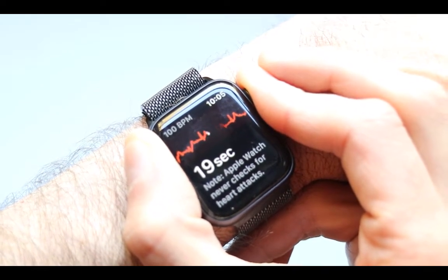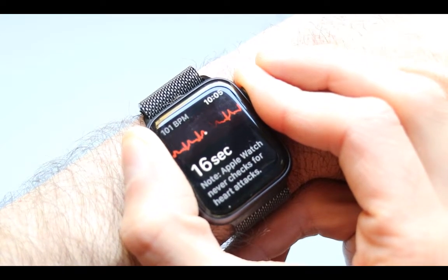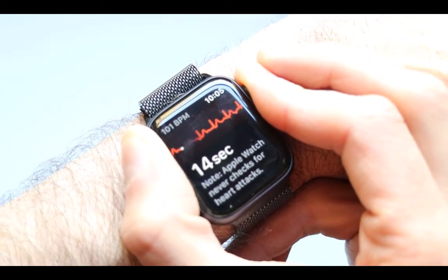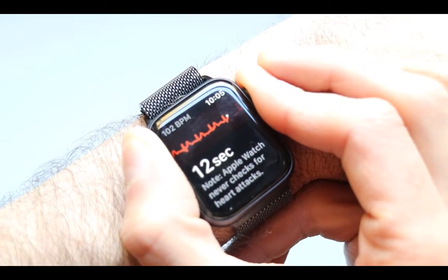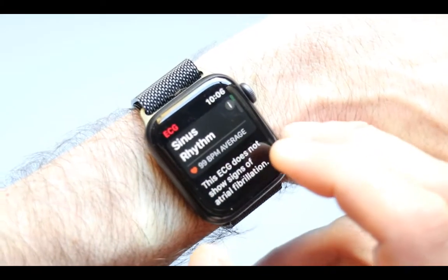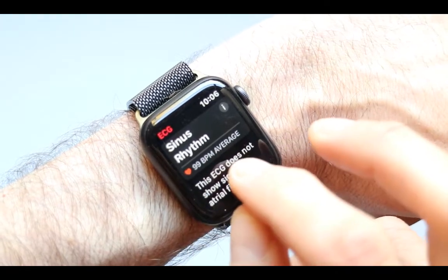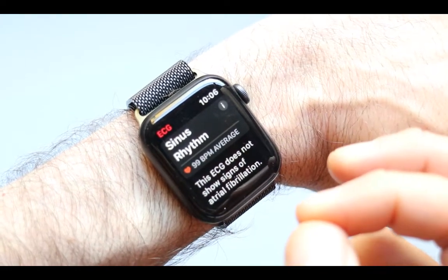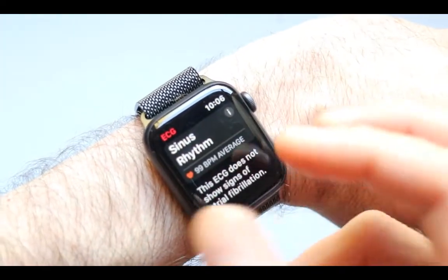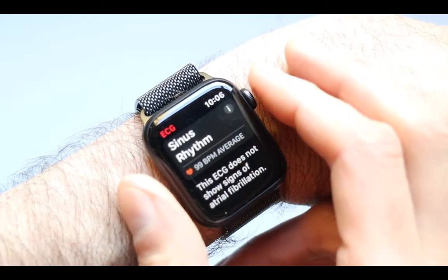Then just wait until 30 seconds passes. Let's see what it comes up with. I have 100 beats per minute right now because I'm talking. Now it says I have sinus rhythm and it shows the beats per minute average. Definitely, if you are talking, your heart rate is going to go higher.